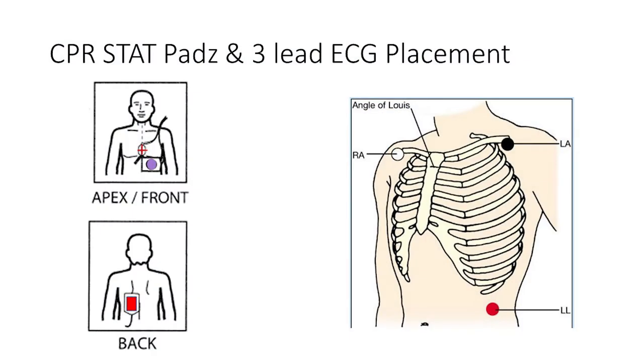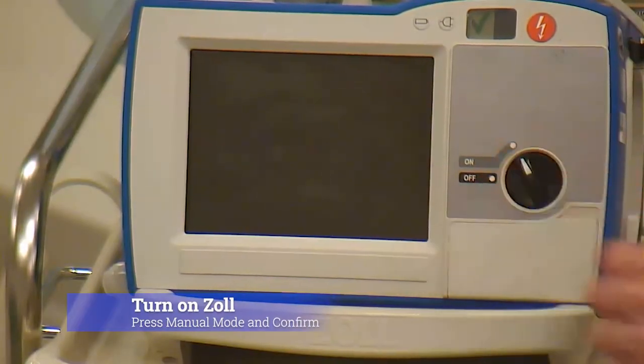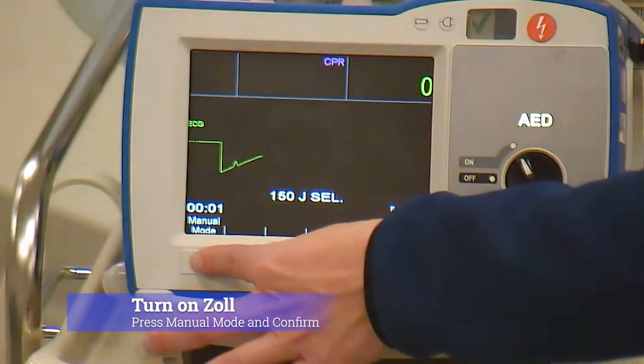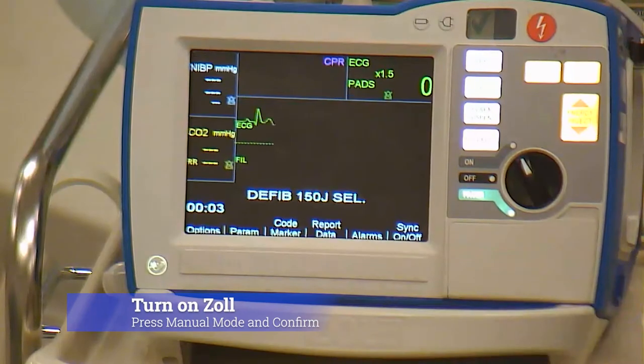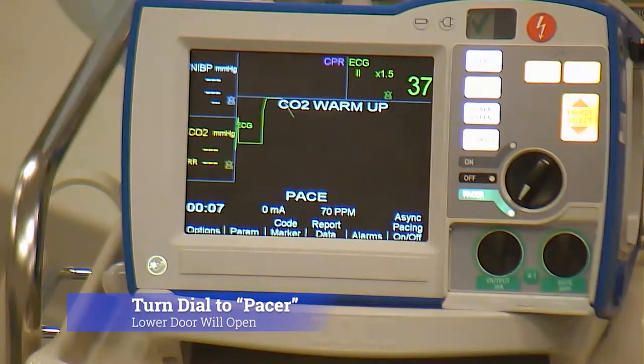Once you've placed your pads and your 3-lead ECG, ensure they're connected, then you're going to turn your device on. Immediately hit manual mode confirm. Turn your dial down to the pacer.